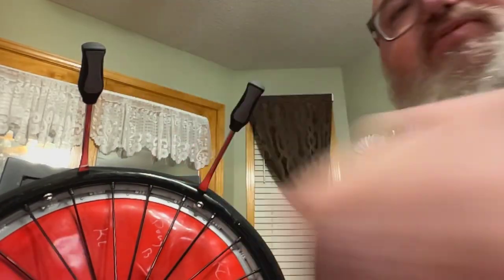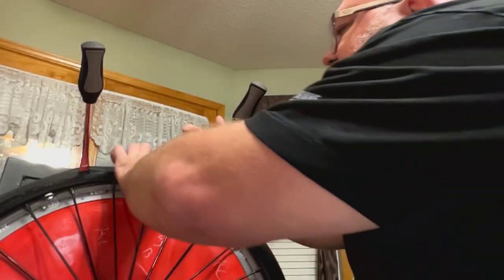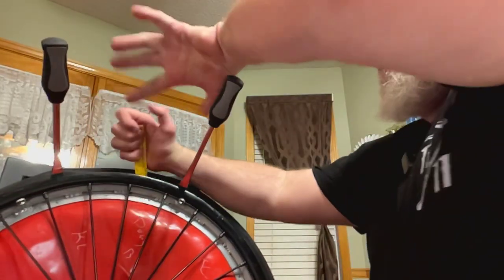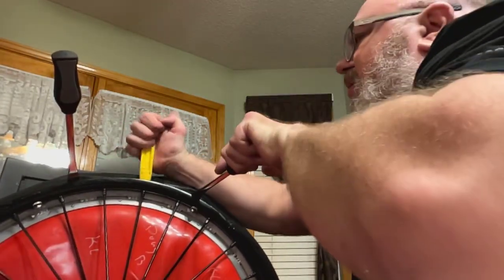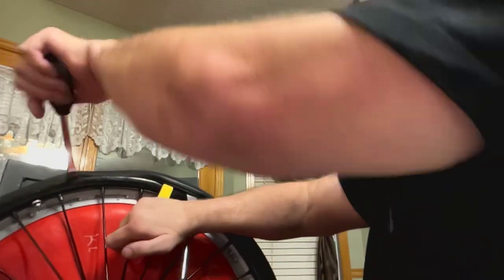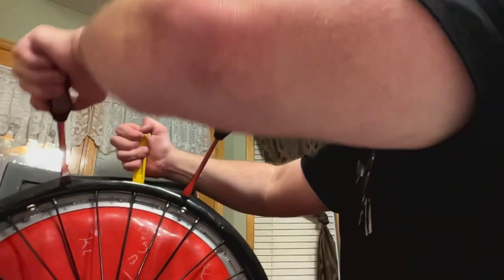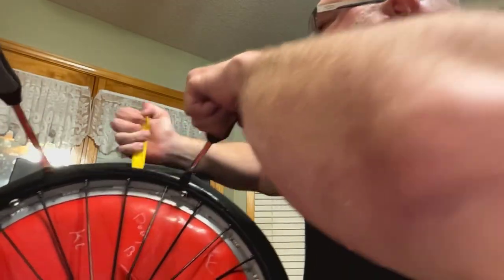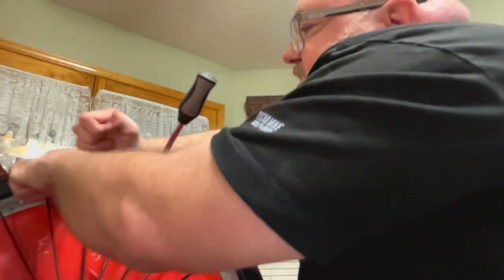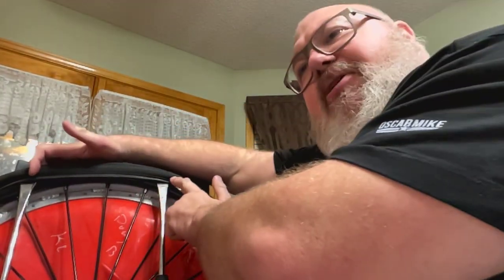So sometimes what I'll do in that case, depending on how lazy I am being as expedient as possible on this one, I'm going to try to work this in here. And of course it didn't, so we tried again. This is all about patience and not falling out of my chair when I'm doing this because it will happen. So over and then over, voila. So that's what I'm looking for, that bead separation.